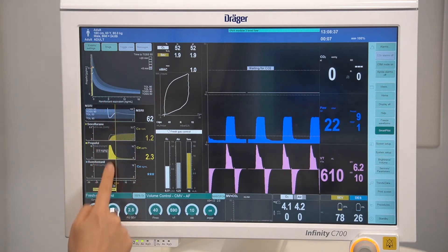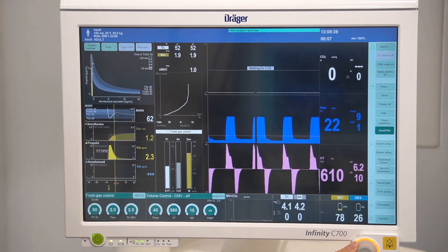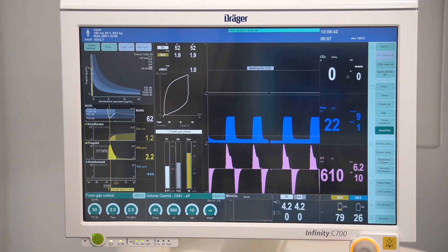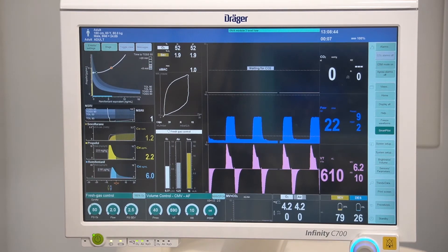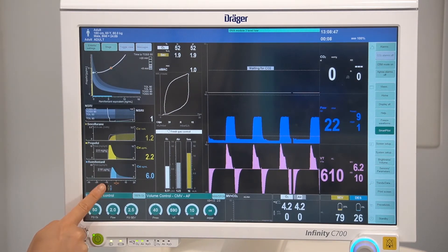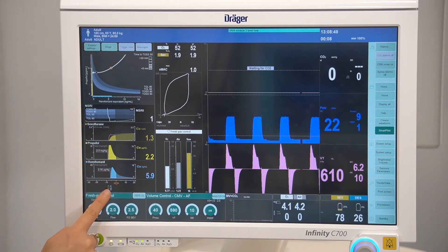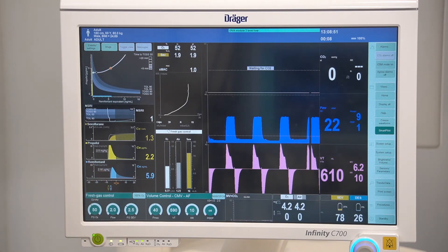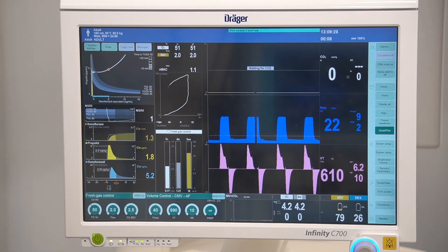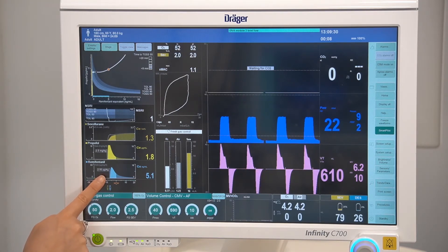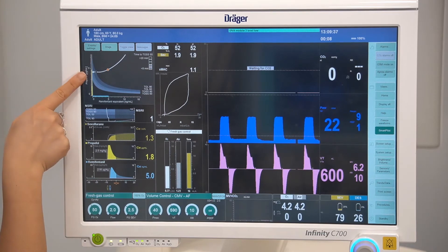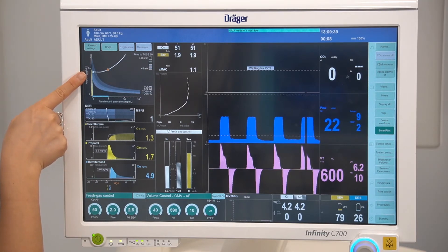Once again, a yellow timeline will be displayed. Using the rotary knob, select the time and confirm. You'll see another colored syringe corresponding with the remifentanil stamped onto the time scale. The effect of giving the remifentanil dose has changed the display on the isobal graph.